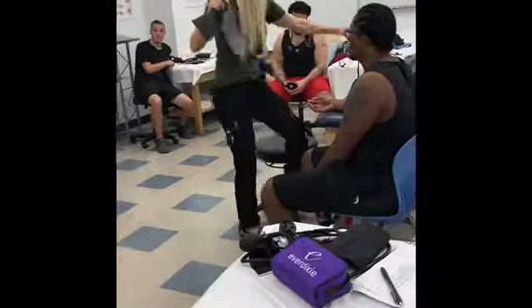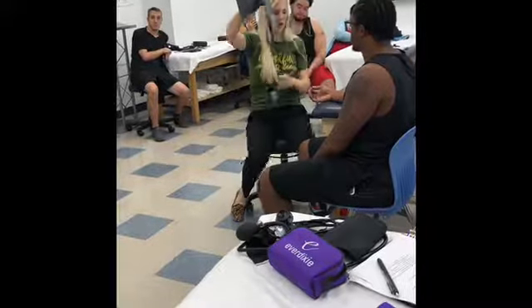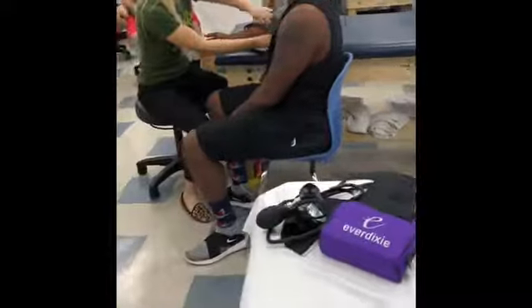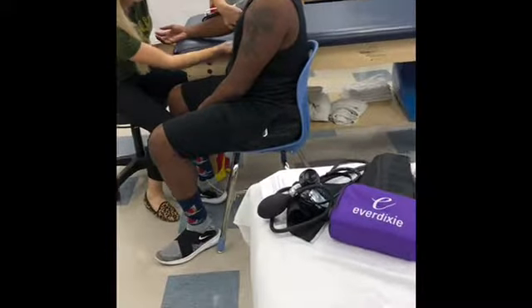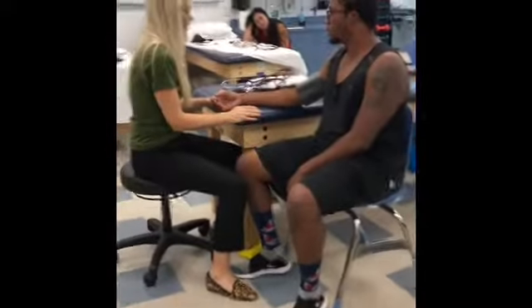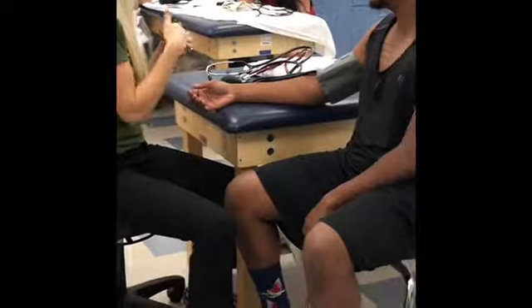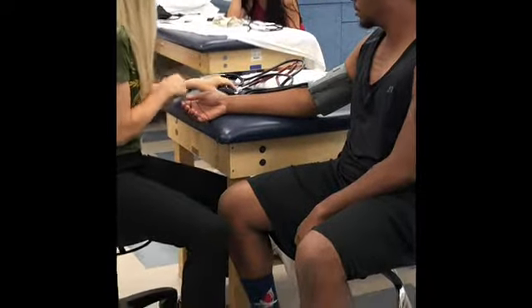Okay, so Q, we're just checking your blood pressure. Kind of tells me some things about your heart and how you're doing. Also, if it's too high, we don't want to do treatment today. So we want to make sure it's a safe range for treatment. It will get a little snug. I'm going to inflate it. It's going to get snug, so if you'll bear with me, I'll deflate that pretty quickly, and it should feel okay.